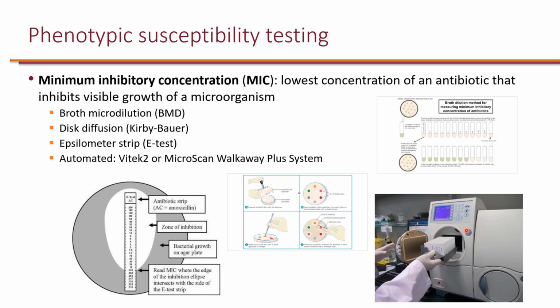These automated systems are most commonly used for the majority of samples. Now, the issue is that because these machines are difficult to make, they typically come preloaded with certain antibiotics.